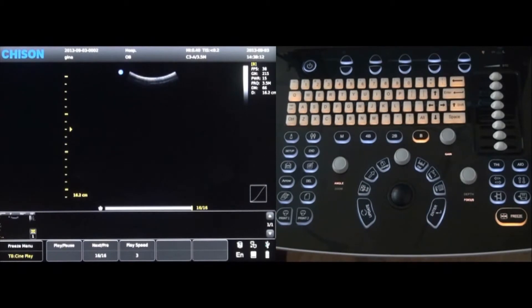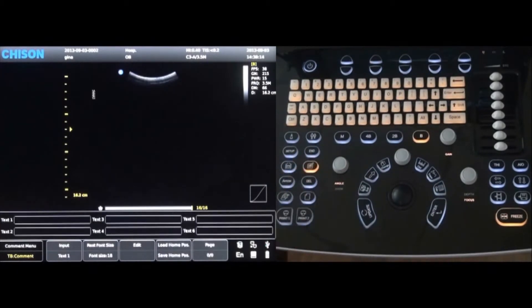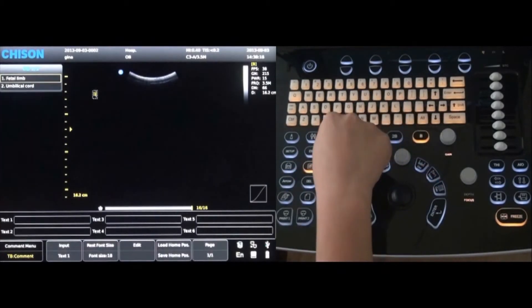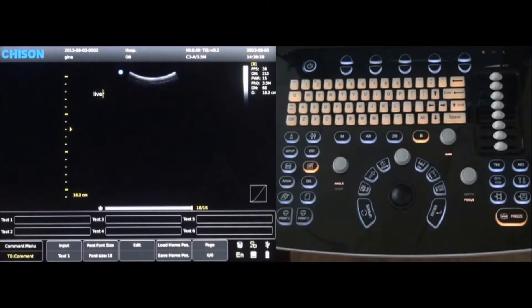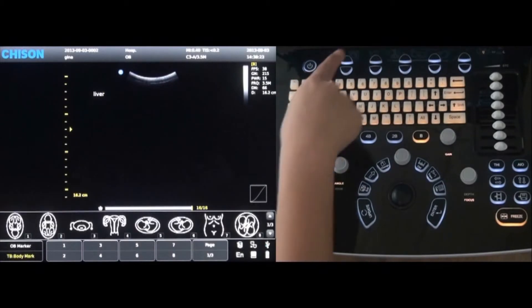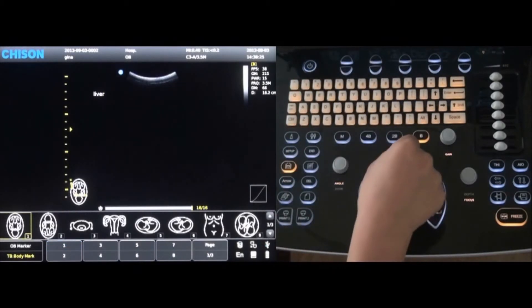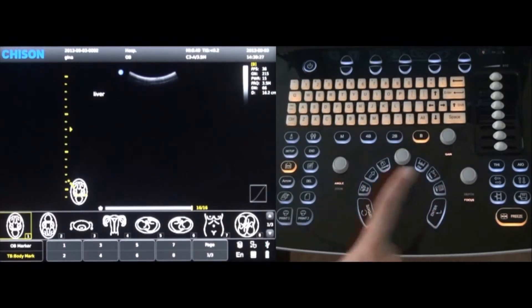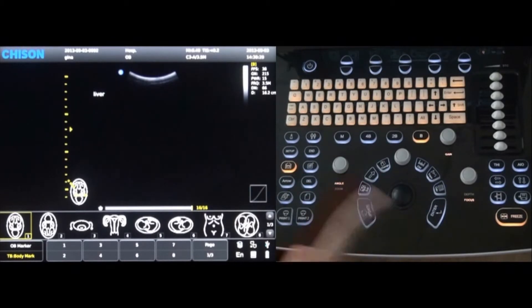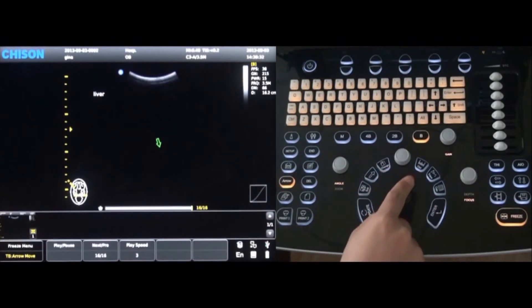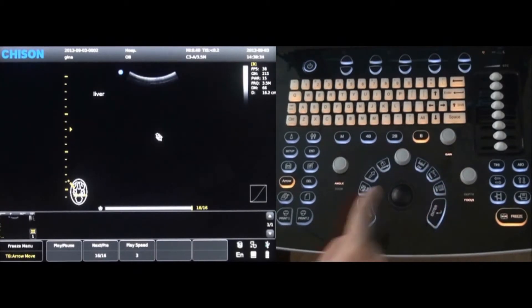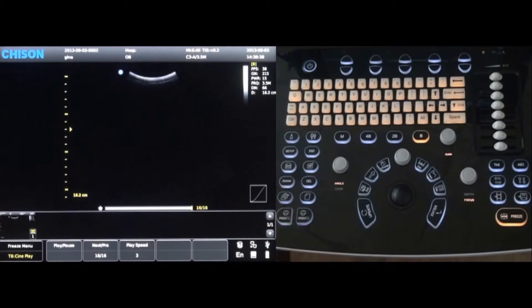Necessary comments and notations can be added to an image by pressing the comment key — simply type the comments on the keyboard and press enter. Specific body marks can also be added by pressing the body mark key and then labeled accordingly. An arrow can be added by pressing the arrow key; use the trackball to move the arrow and press enter to place it. Press the delete key to remove notations.